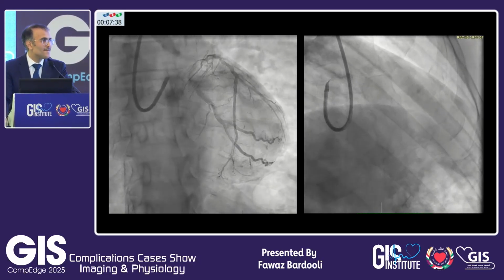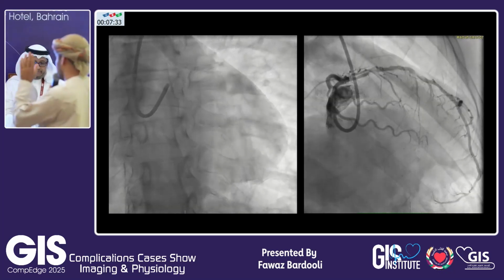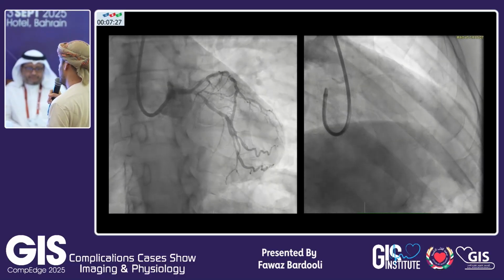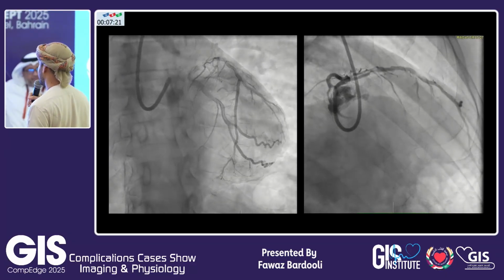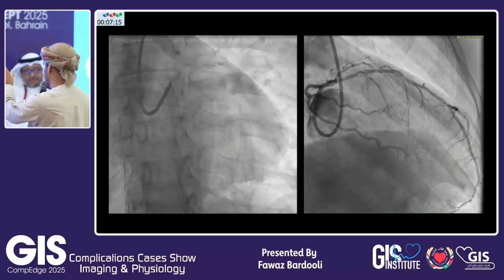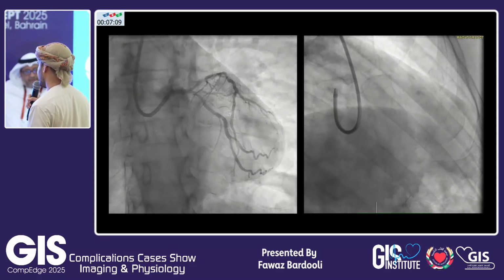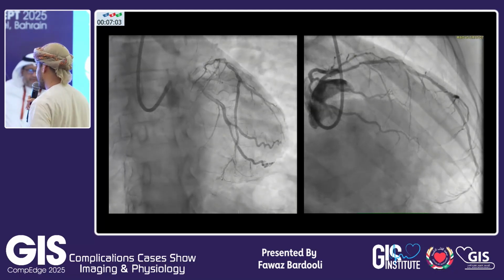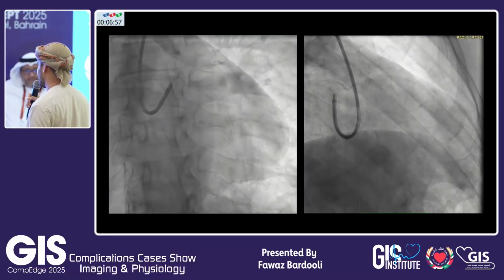Let's make this interactive. What I can see angiographically is dense calcification, just before the contrast, of the proximal LAD and the circ. There is diffuse high-grade atheroma in the ostioproximal LAD. It seems quite significant high-grade stenosis, followed in the mid-segment by a hazy lesion, most likely calcified plaque. There is a moderate stenosis in the ostioproximal circ of doubtful significance, in the borderline range, and then a distal segment again with 60 to 70% stenosis.